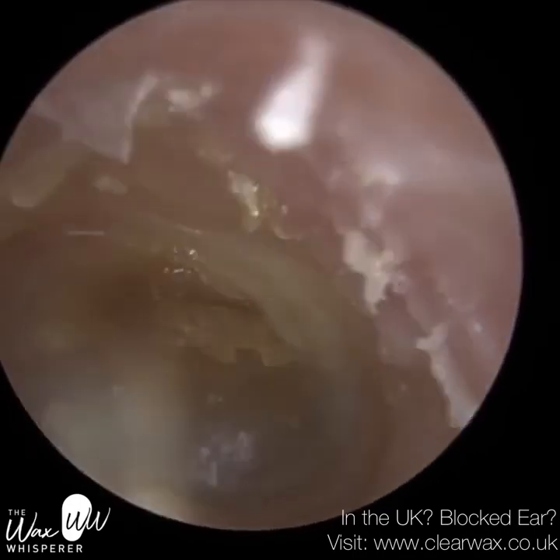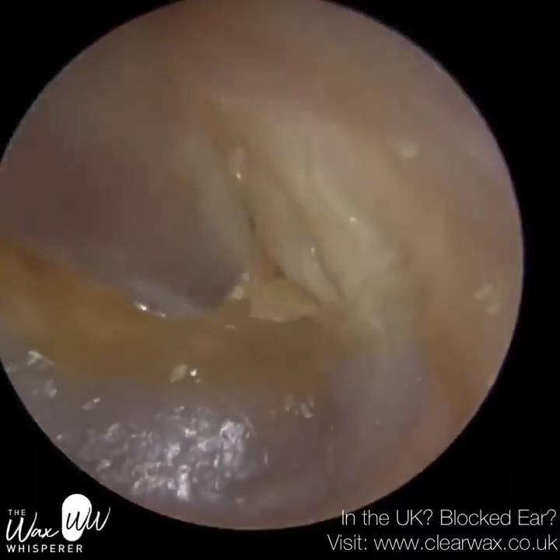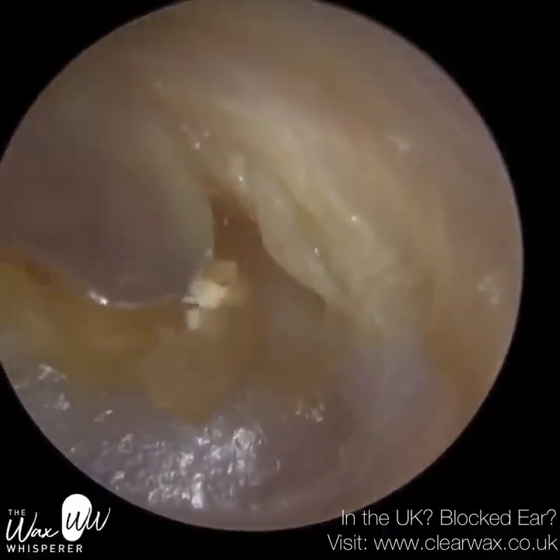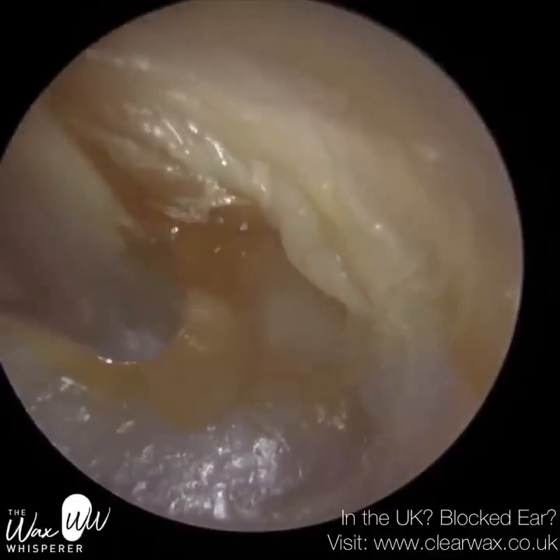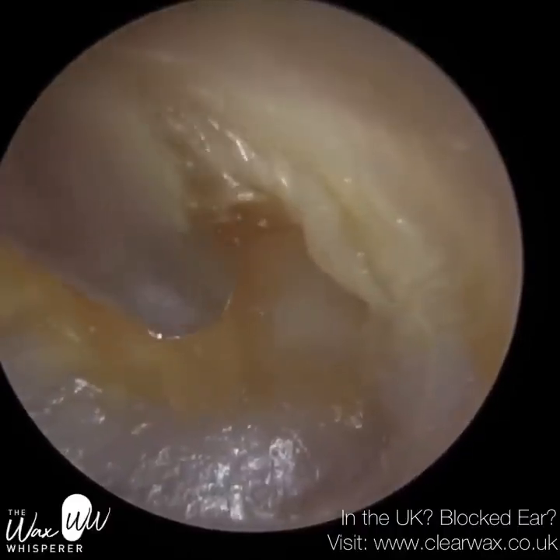You will see that this patient has evidence of a previous cholesteatoma, so do stay tuned. So what I'm trying to do now is remove the skin out of this retraction, and we're just going to be careful because the patient has got a very thin eardrum as well. It's a hyperflaccid eardrum, so it vibrates more than usual, and it's like peeling away an onion.